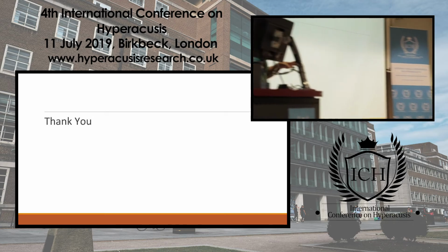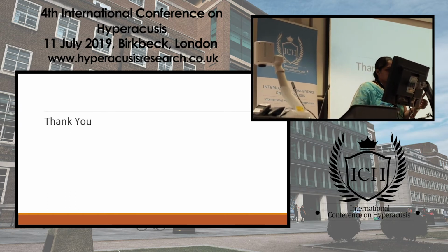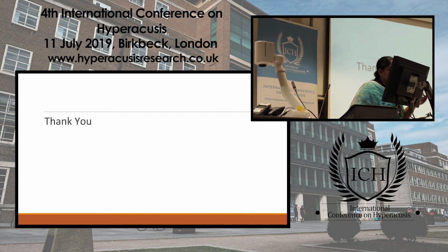Sir, with respect to this case, the child had an upper respiratory tract infection, and OAE is one of the sensitive tools. If an upper respiratory tract infection or even a slight cold is there, there is a high chance that OAE can be absent.